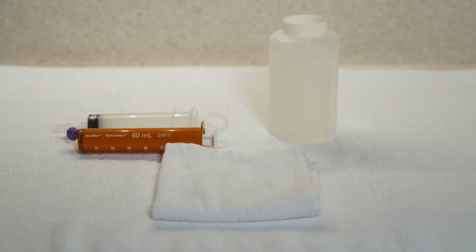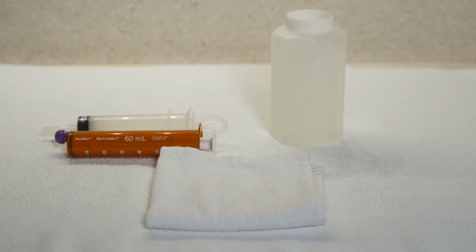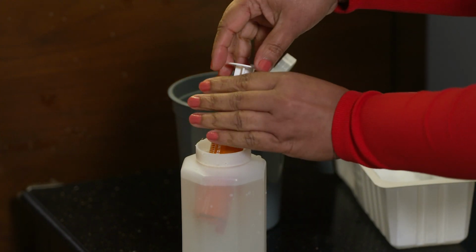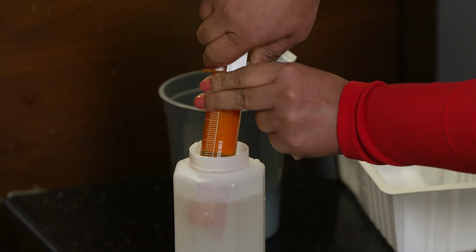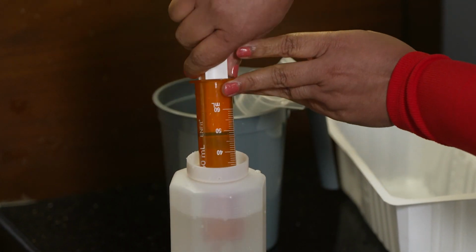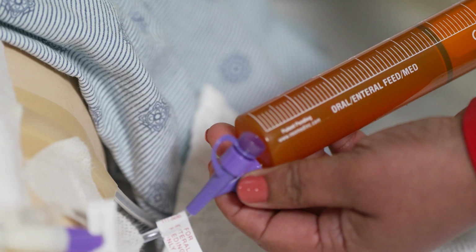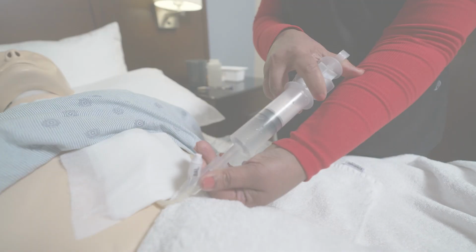Manual flushing is very important to prevent clogging in the J-tube. You will do manual flushing in addition to automatic flushing. Flush the J-tube 2 times a day. After washing your hands, fill the 60 milliliter syringe with 60 milliliters of tap or bottled water. Make sure the syringe is free of air. Gently push the water into the J-tube to clear the feeding formula.